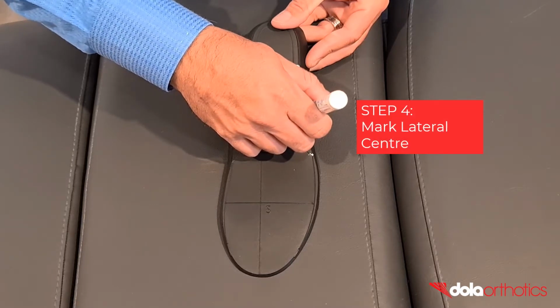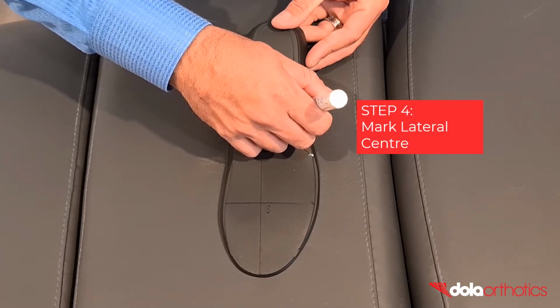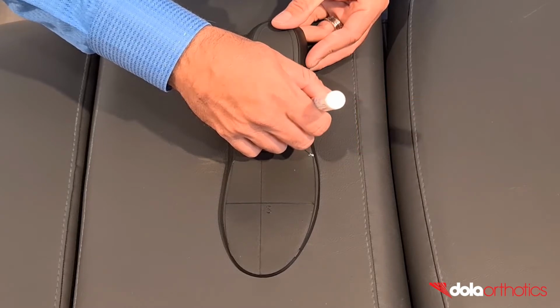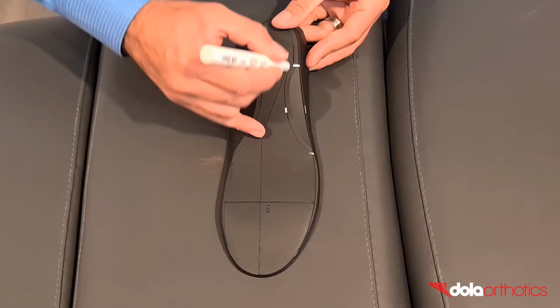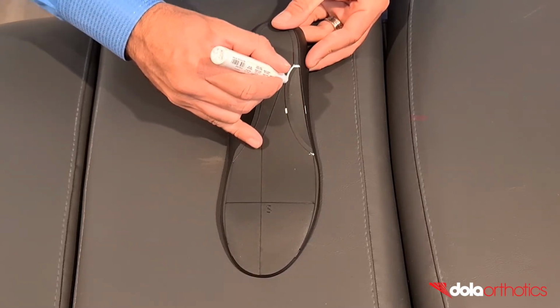Step 4. Mark the lateral center point of the grind. This point determines the aggressiveness of the lateral support grind. The more material removed from the lateral arch reinforcement, the greater the reduction in control.